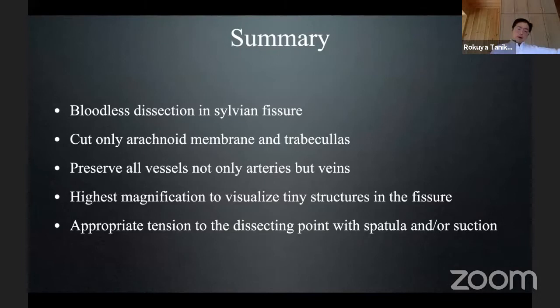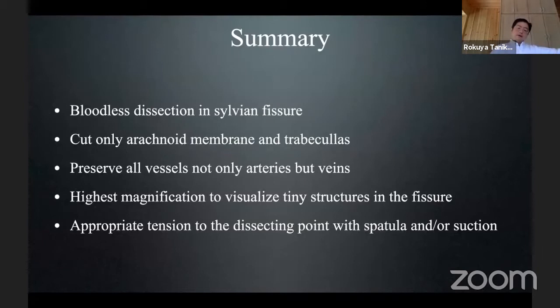Broader dissection in the sylvian fissure — you can cut only arachnoid membranes and trabeculae. You cannot sacrifice any vasculature. Preserve all vessels, not only arteries but also veins. Highest magnification to visualize tiny structures in the fissure.